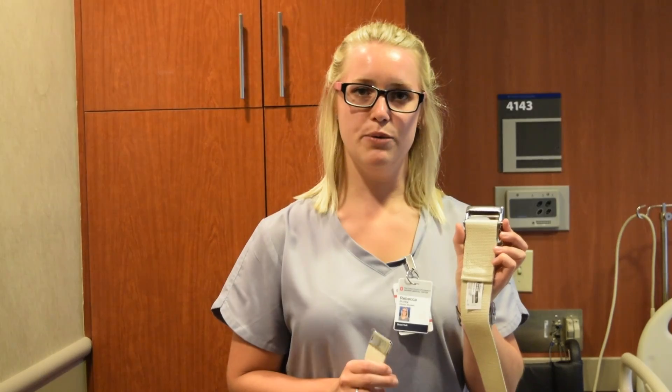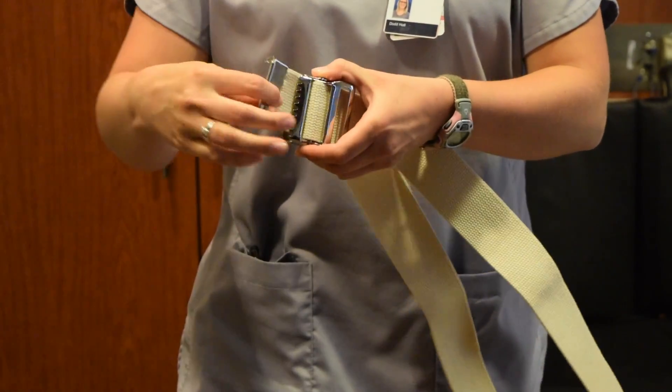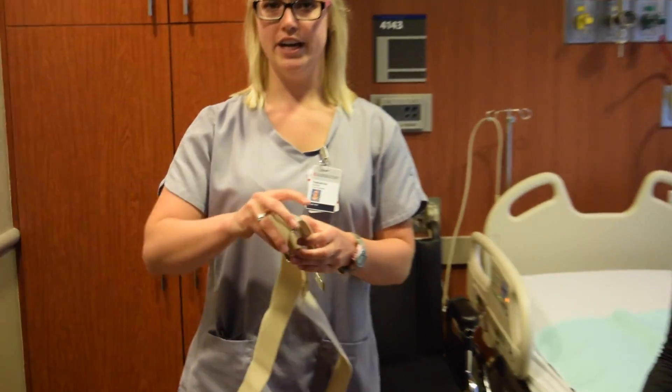I'm now going to teach you how to put a gait belt on a patient. The first thing to remember is that the tag goes on the inside. You then want to put this end through the teeth side first, bring it through the other end, and pull tight. I'll now demonstrate how to put it on a patient.